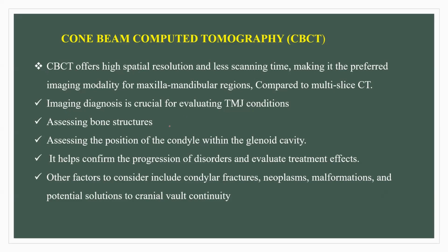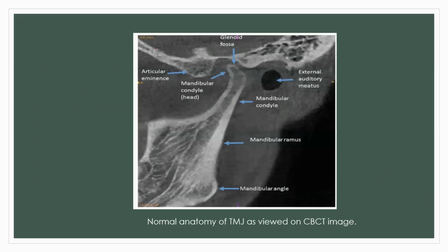We can see almost all the pathological conditions, assess the bony structures, assess the position of the condyle within the glenoid cavity, helps to confirm the progression of the disorders, and also how the treatment that is being done is progressing. Okay, evaluate the treatment effects, and also the other factors to be considered in condylar fractures, neoplasms, malformations, etc.